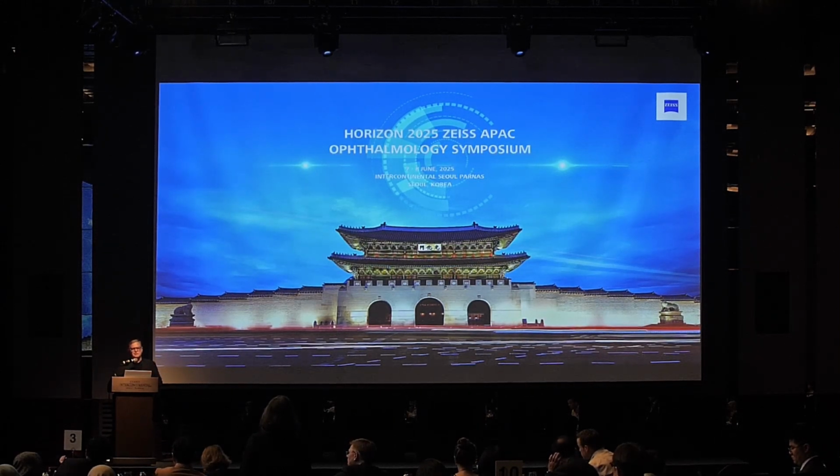Even though on the IOLMaster you have, whatever, 0.81, which is below 1 diopter, I would consider that if I go from 12 o'clock, I may induce astigmatism, and if I go from temporal, I may not reduce it. So I would go for a toric version if the lens is available. So basically, you're looking at an outcome aiming at less than 0.5 diopters of astigmatism. Yeah, as much as possible. Thank you very much.